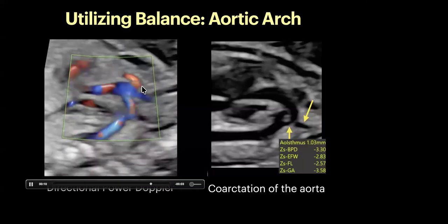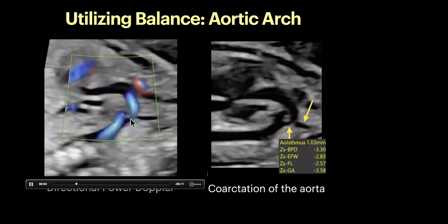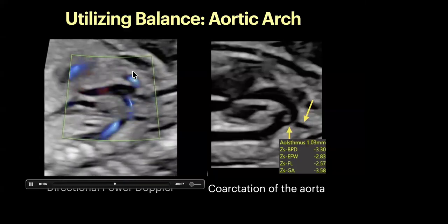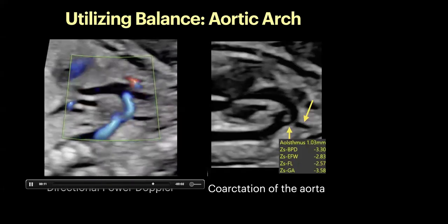And of course, with color Doppler, demonstrating this area. So really, that's something to be mindful of, and I'm utilizing the balance with directional power Doppler to help me identify this area.